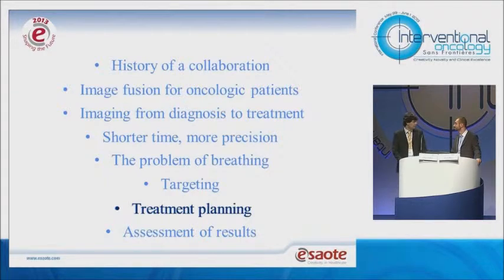Treatment planning. This, of course, is not particularly important when you are going to treat a small lesion, but it becomes very important when you face a larger lesion. Because for large lesions, even using sometimes the most modern and most advanced devices for ablation, you cannot be absolutely sure to be able to cover the entire tumor, plus the peripheral safety margin, with one single insertion.